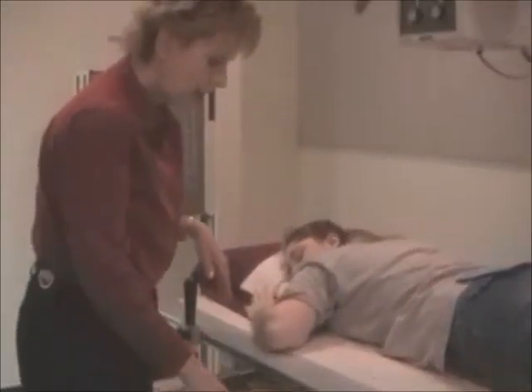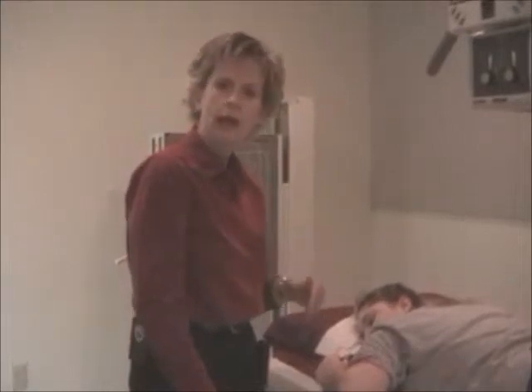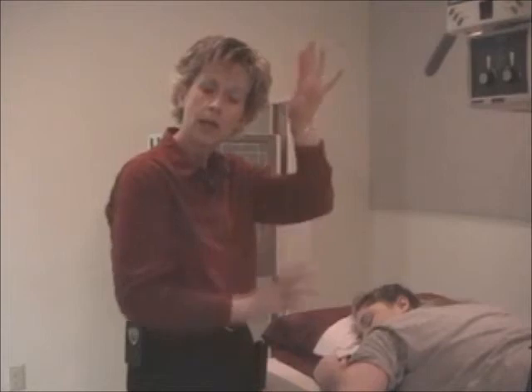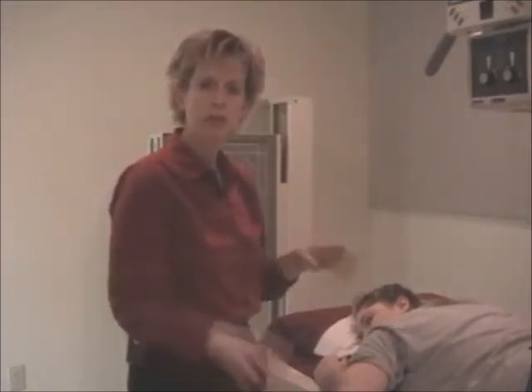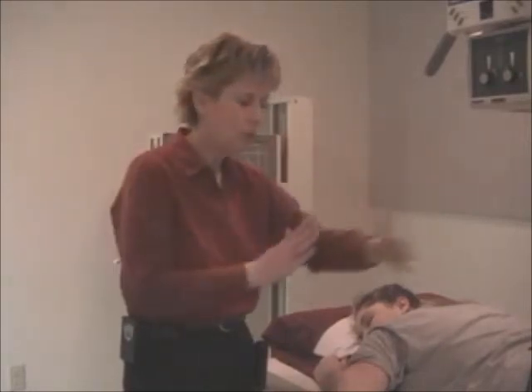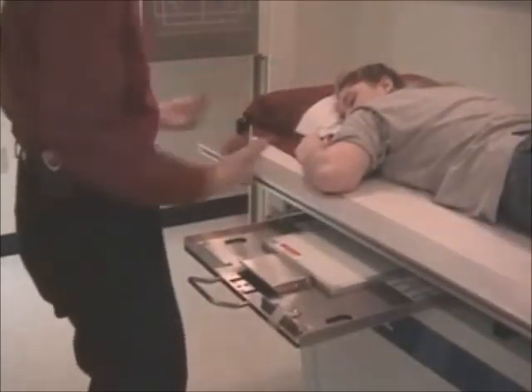And I'm going to a crosswise mode because when you're in an oblique or a lateral position, the stomach tends to elongate, so the film goes lengthwise. When the patient is in an AP or a PA position, the stomach tends to go more transverse. So we want the 12-inch axis to be wider across the body. And I'm putting the ID blocker towards you, towards the tech.